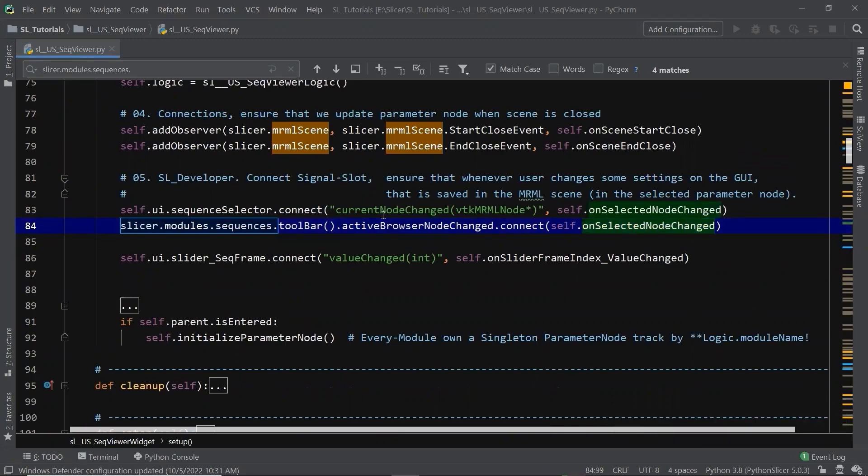We are not done yet. Let's navigate to the slot function on selected node chain. Go to step 2, UI update.